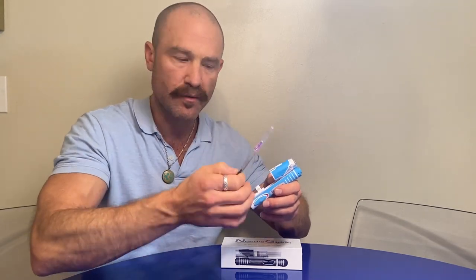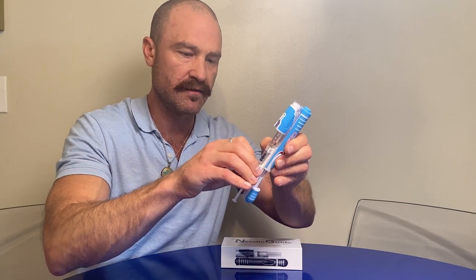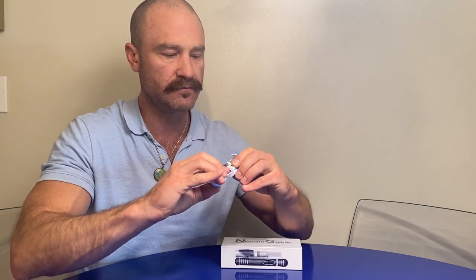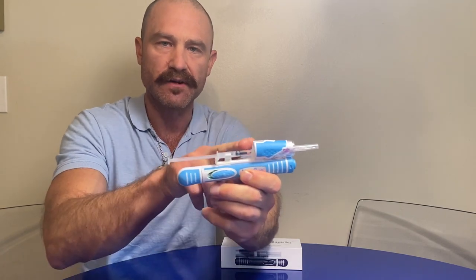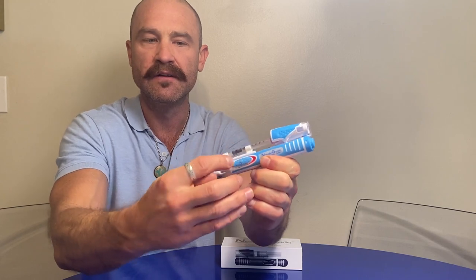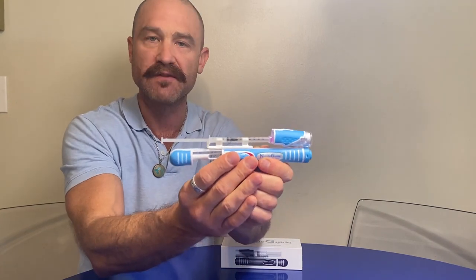All you're going to do is take your prepared injection, load it into the needle guide, and it just snaps in, just like that. Make sure it's lined up with the end right here of the needle guide. This is what it's going to look like before the mechanism is engaged. You will pull back the mechanism, and you'll see that the red indicator is indicating that the safety is on, so we can't fire the injection without taking the safety off.